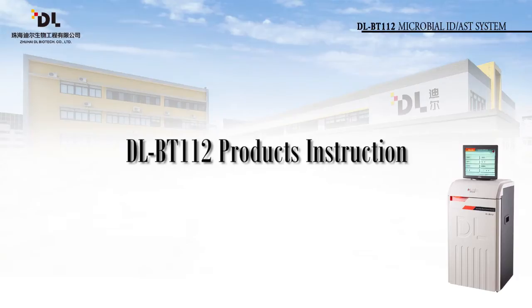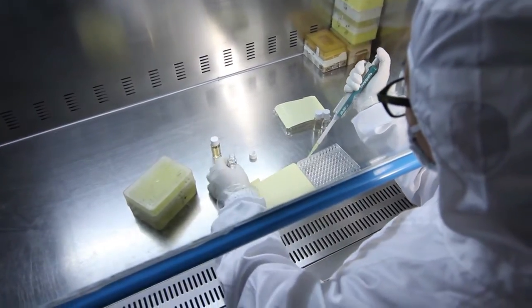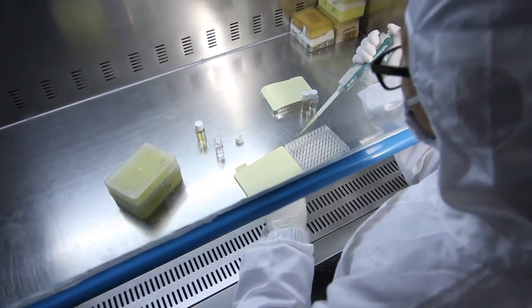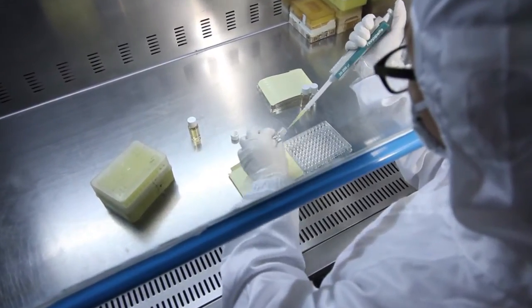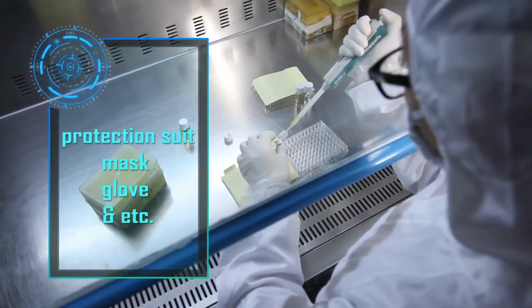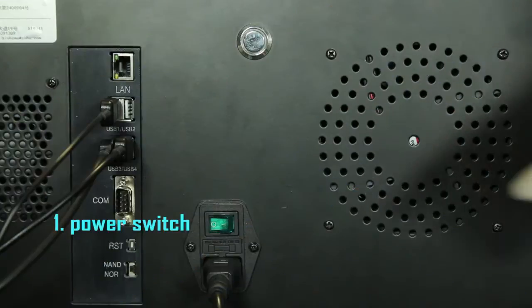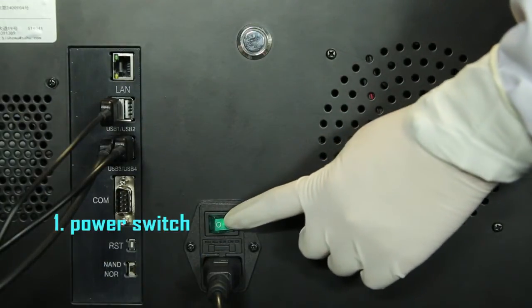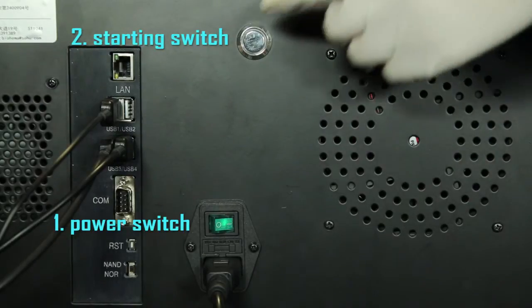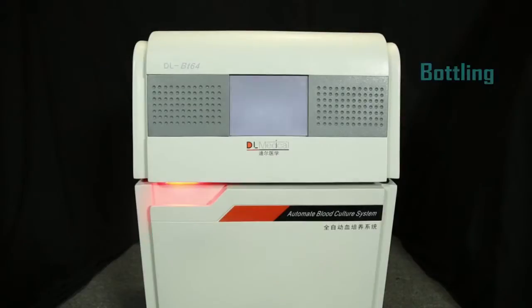Section 3: DLBT112 Product Operation Instructions. This product is for use by qualified medical personnel in medical units only. When operating the system, please use individual protection such as a protection suit, mask, and gloves. Turn on the power switch on the back side and press the starting switch. After the system boot is completed, the menu will be displayed.